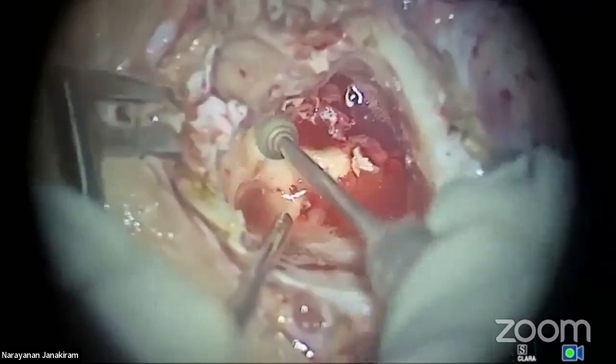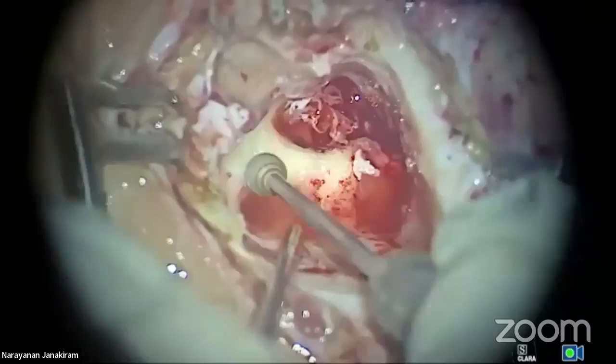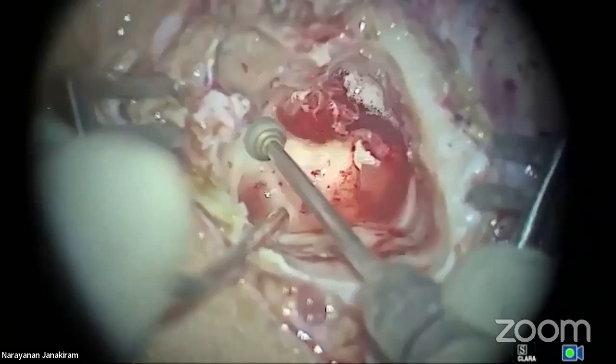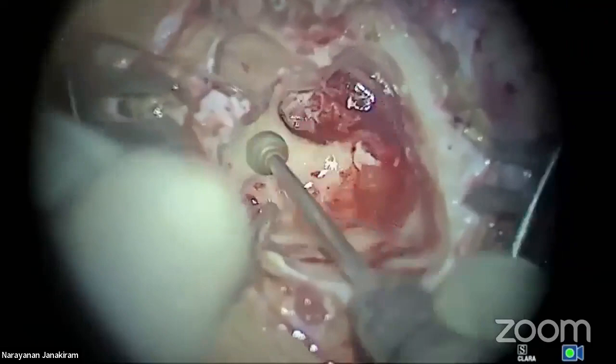So this is very important, my dear friends, to reduce the facial ridge completely. You should not have even a small hump. If you have that, you are into trouble. Get my point, my dear friends? See that. I'm doing that with diamond just because I want to show the juniors, don't use the cutting here. Of course, I do it in a regular case with the cutting.